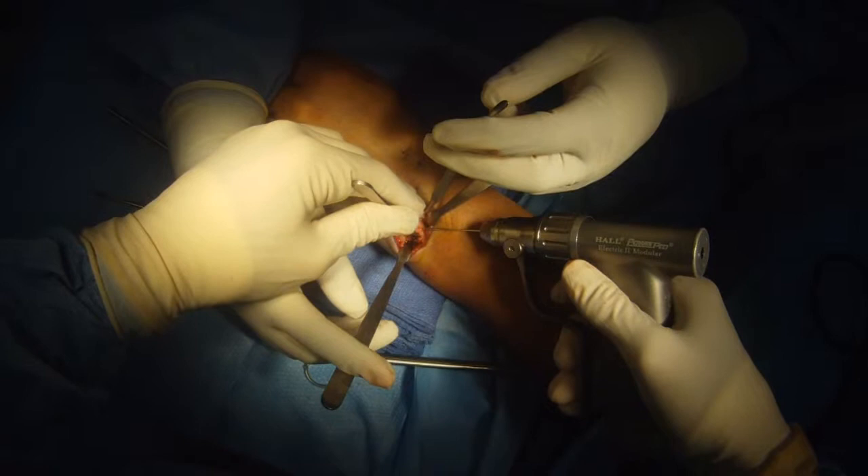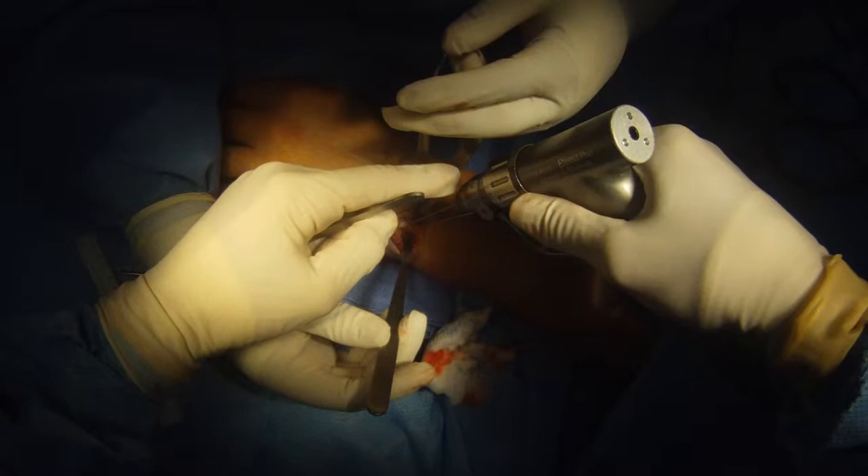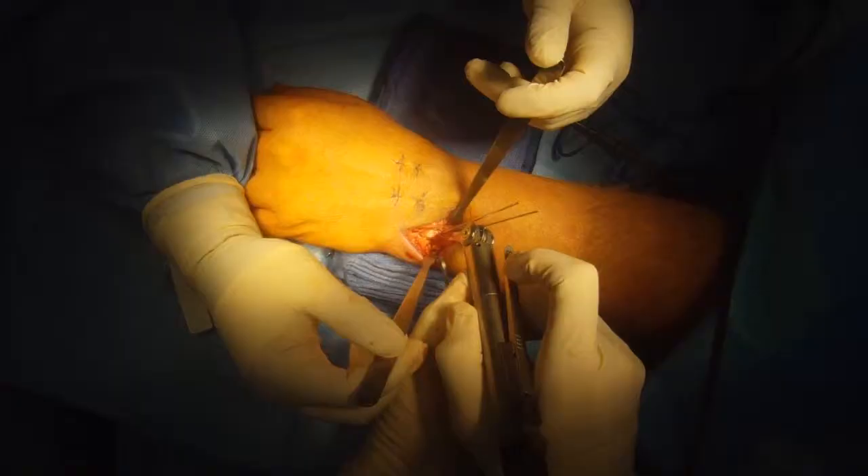Dissect out the ulnar head and neck and place a couple of K-wires in the neck. This will serve as a guide for the saw cuts that we're going to do. I confirm all of this radiographically.